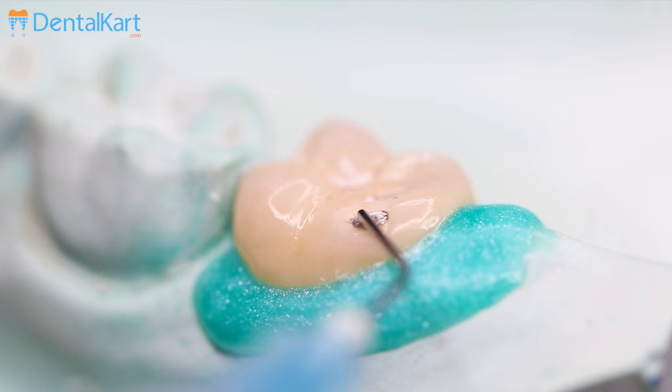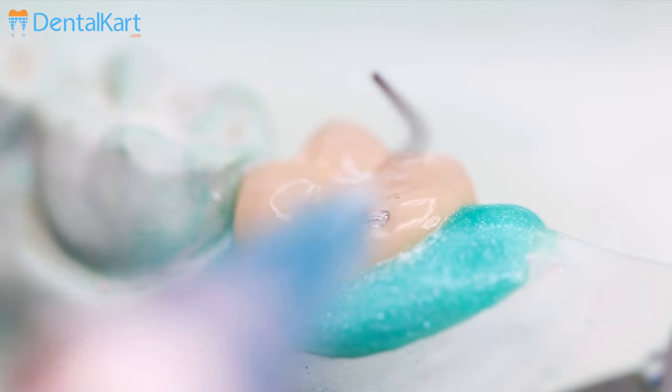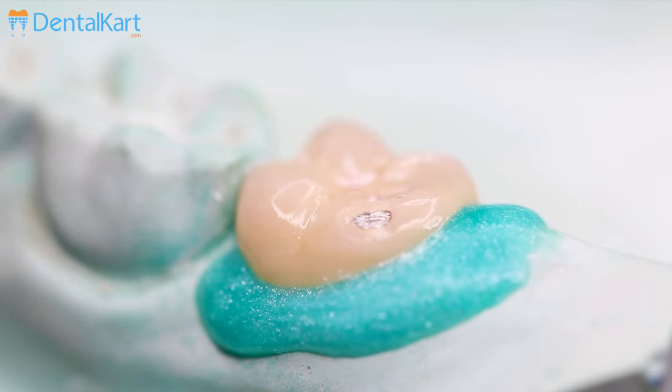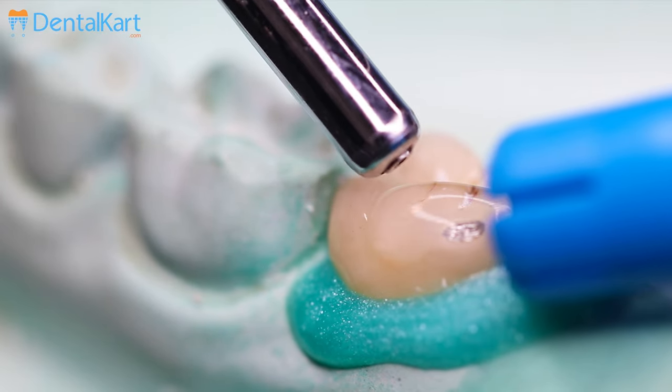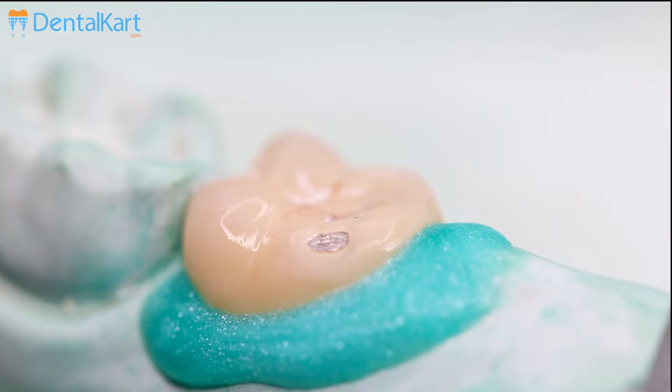Be careful to avoid enamel and dentin. Slowly express an even coat onto the required surface for 90 seconds. Rinse and suction the applied porcelain etch from the surface and dry completely. Etched porcelain should have a frosty appearance; if it does not, repeat the etching process.